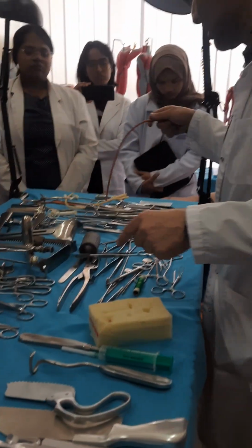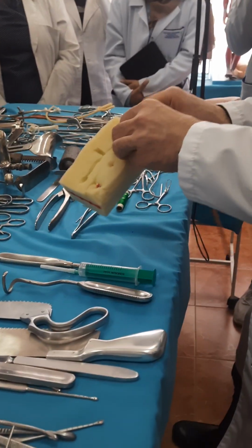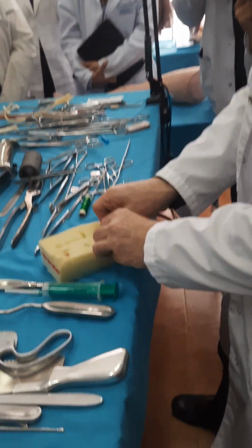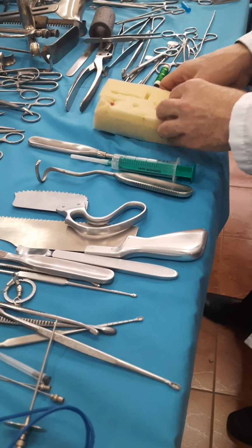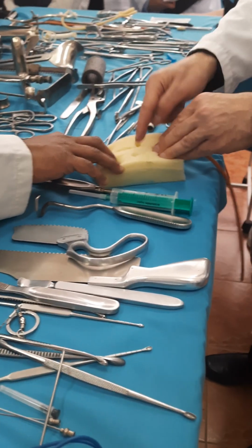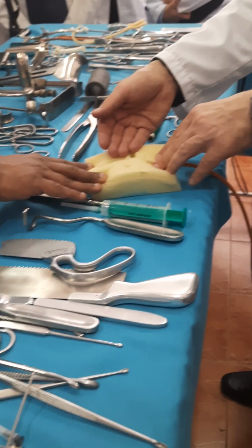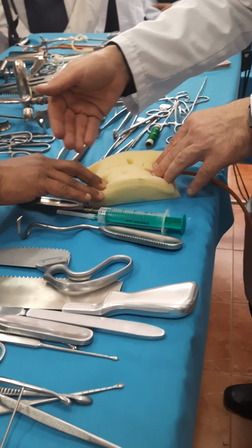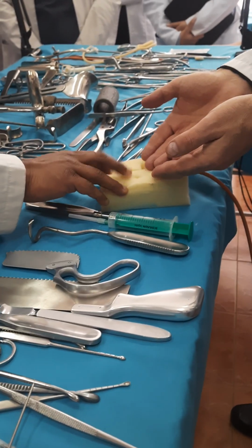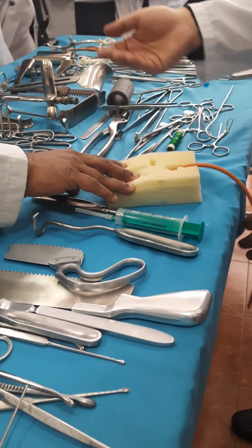Now let's model the situation. For example, this is the main artery which supplies this region. Inside of the wound, hold it please, I don't see the place of bleeding, I see surface bleeding. For example, burning wound, crushing wound, inflamed wound. If I don't see the place of bleeding, sorry, how can I apply arterial forceps? I cannot do it.